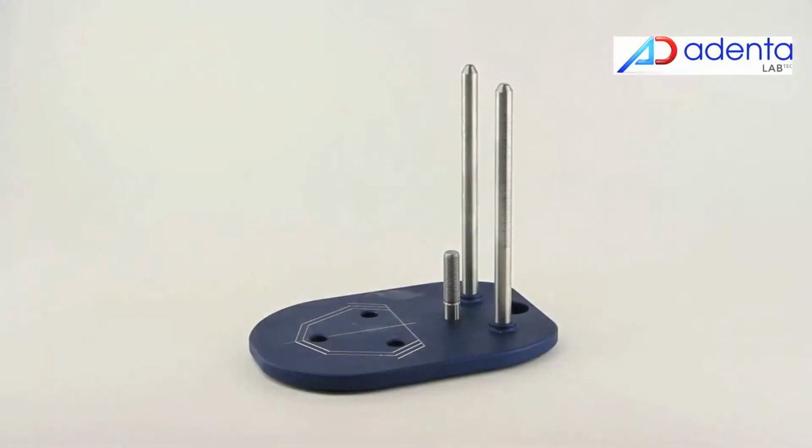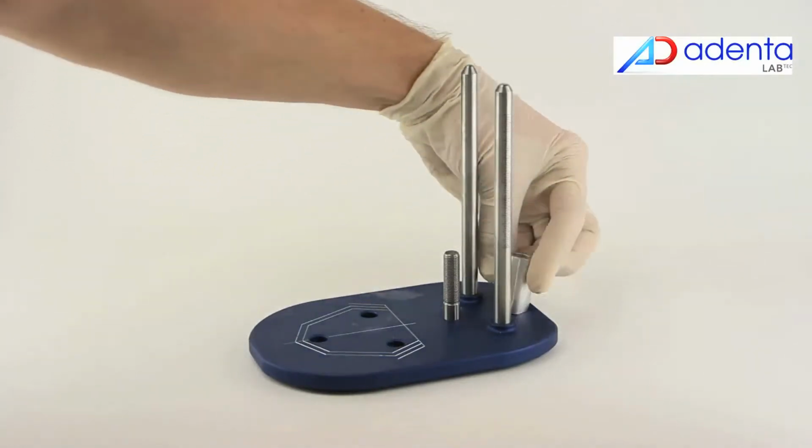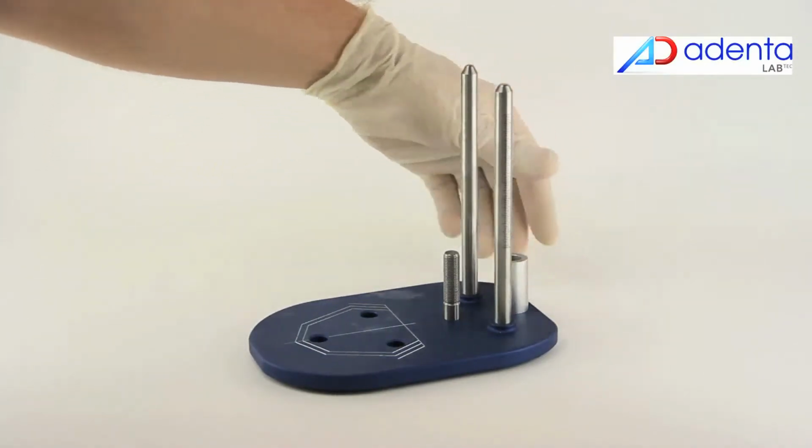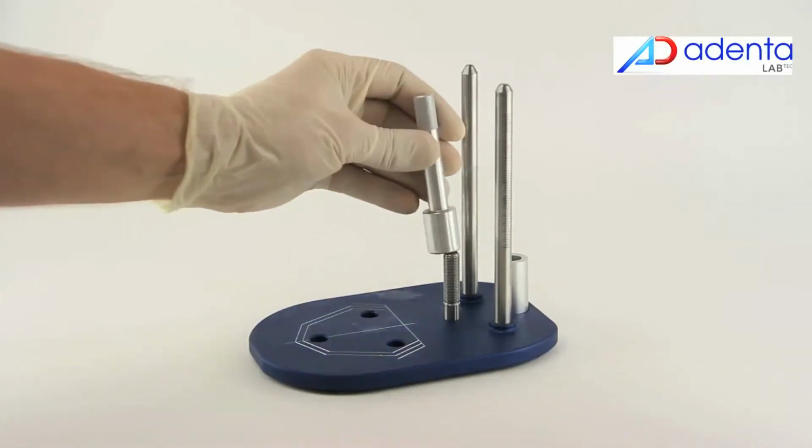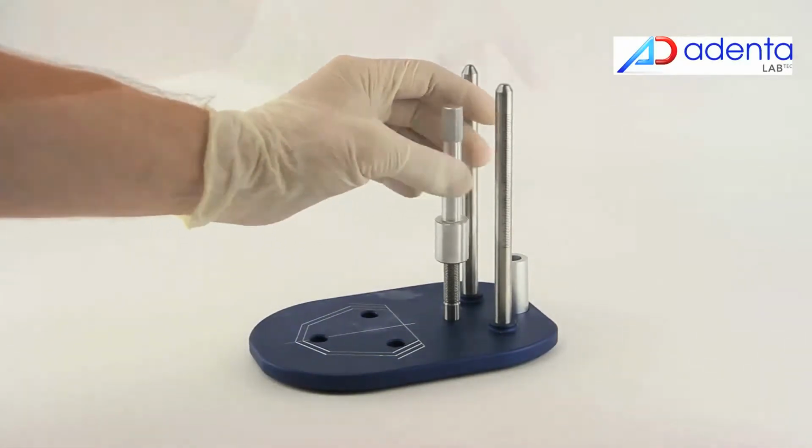Chapter 1: Model Maker Parts. Single workstation base, universal for all LabTech appliances. Distance tube and model base height adjusting screw.